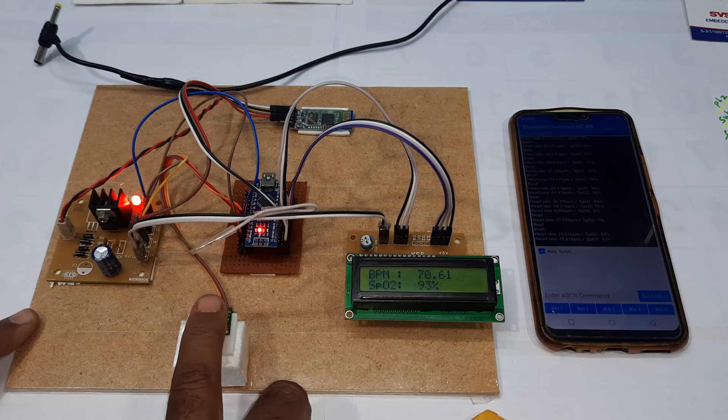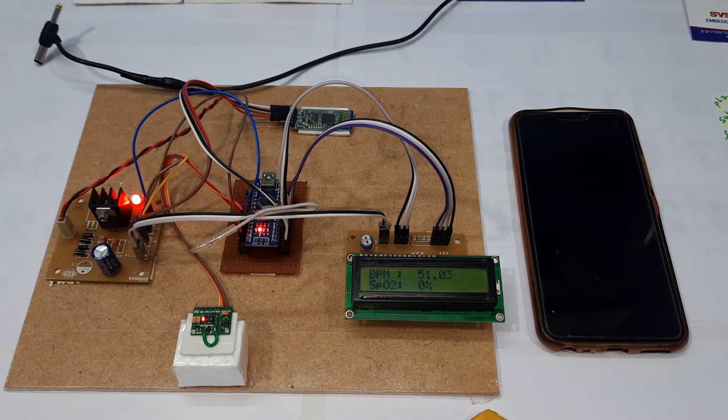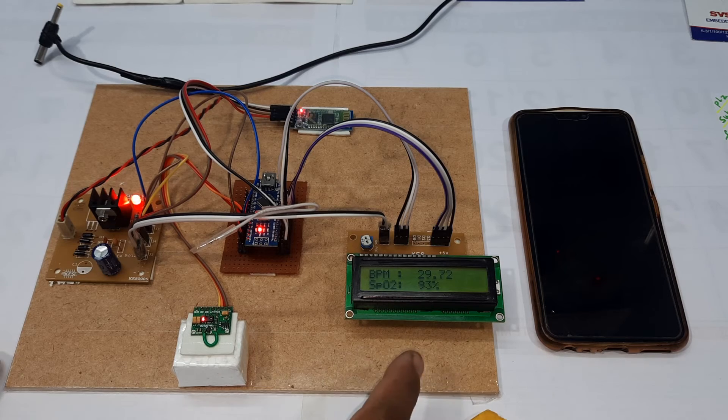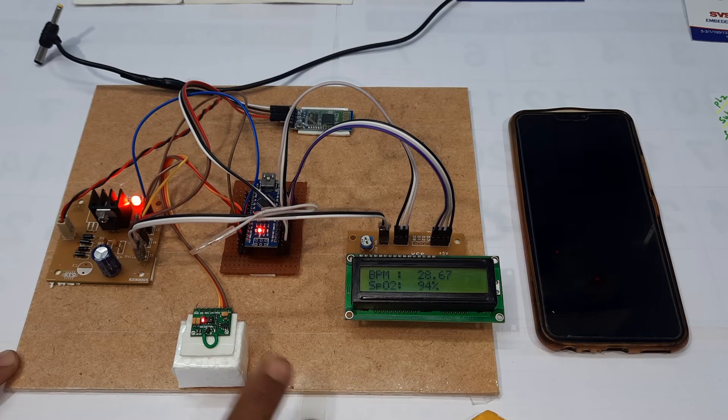This is just for development purpose. We can also add a temperature sensor — the MLX remote temperature sensor or the LM35 temperature sensor. We can also add ECG functionality to this project.